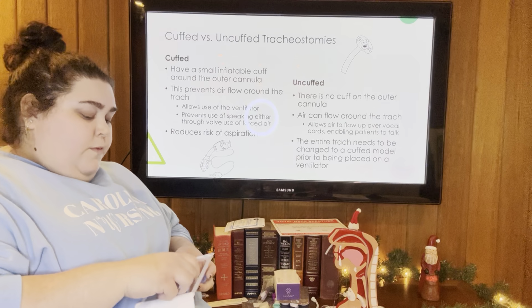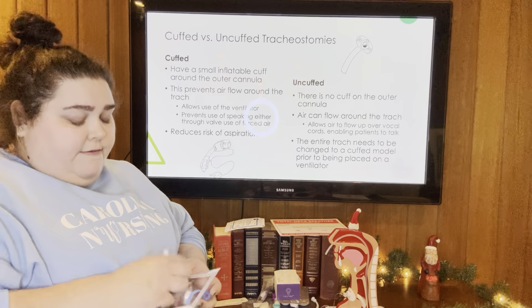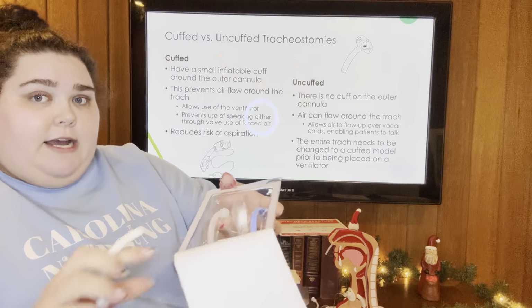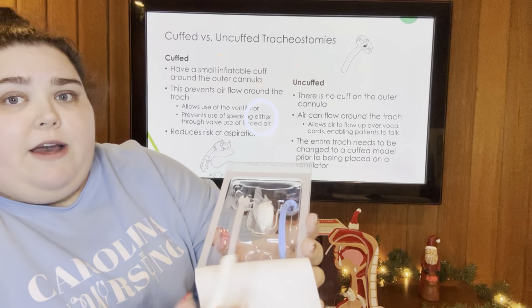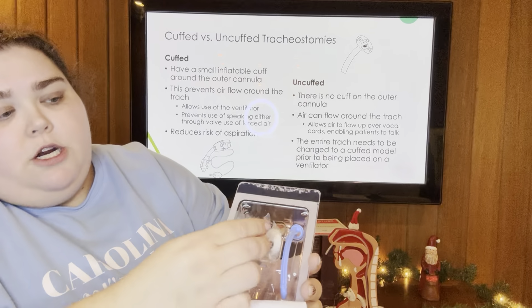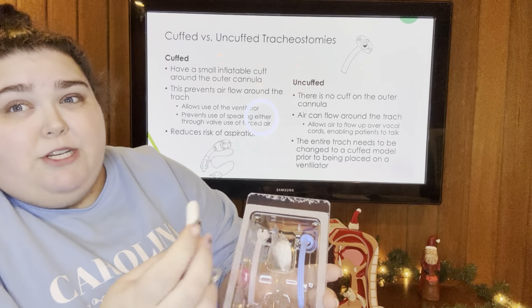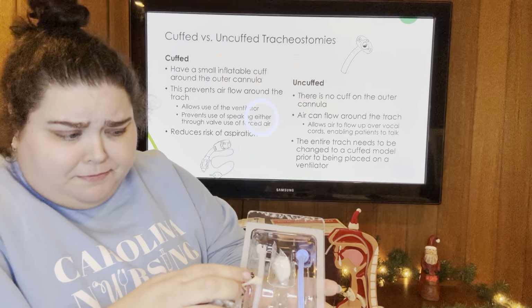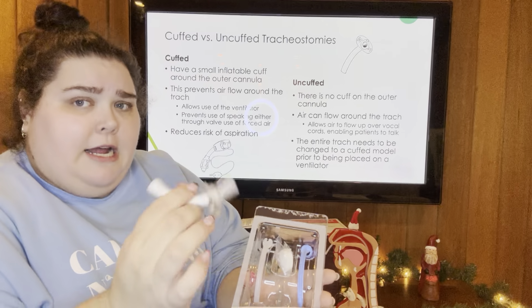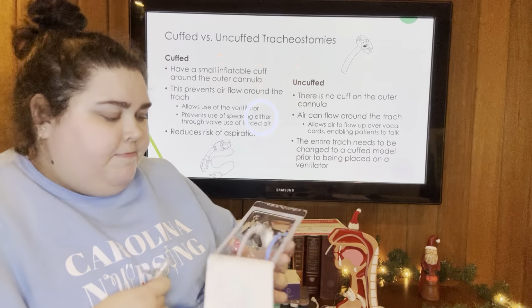So we have the bits that come in a case. If you ever replace a trach, you'll have it kind of, so this is the brand new kit. So you have your obturator here, your kind of janky trach tie there, which isn't the pretty one. It's not the Velcro one that we prefer, but it does in a pinch. You have your inner cannula, and then you have your outer cannula trach.